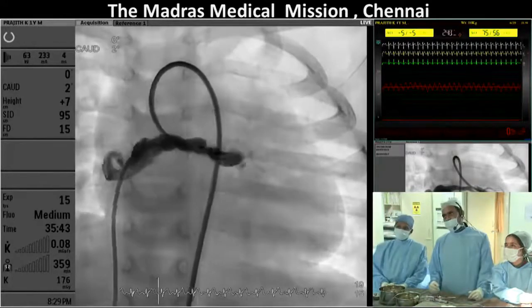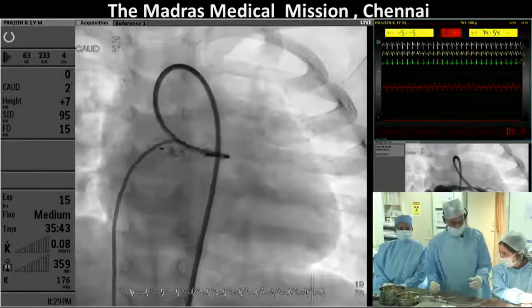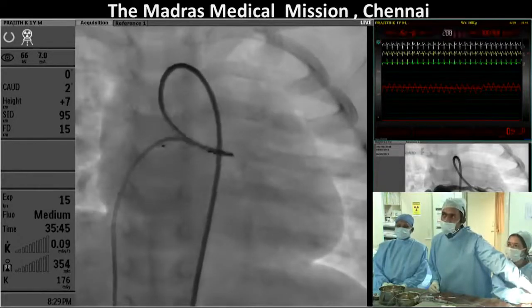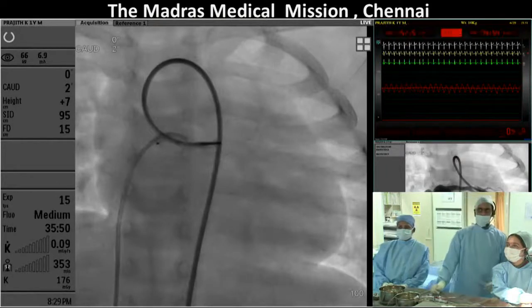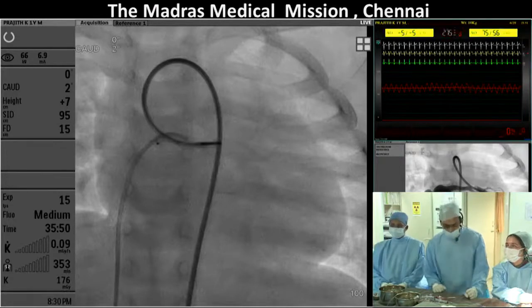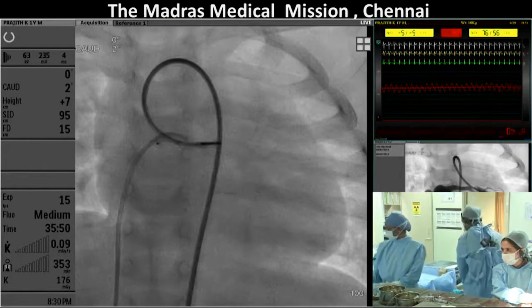Well, from this retrograde approach, yes. From the retrograde approach, yes. But if you were doing it from the venous approach, then you've got much more control about locating that plug near the circumflex coronary. But I think with this retrograde approach, you won't have that control. So through the venous side, now I'm going to put in some coils. Let me make one other comment here.